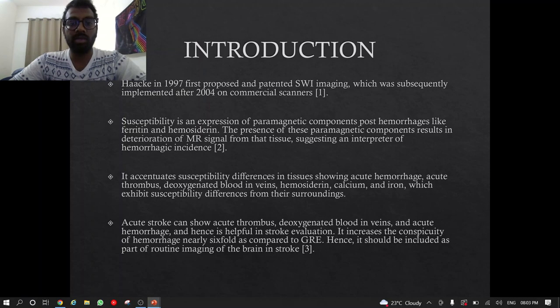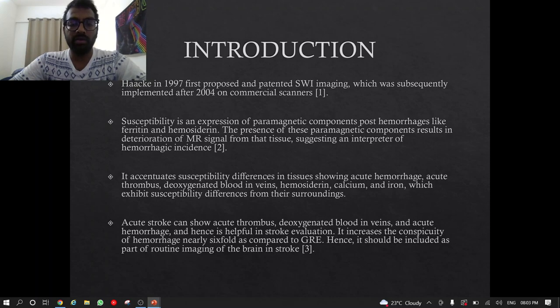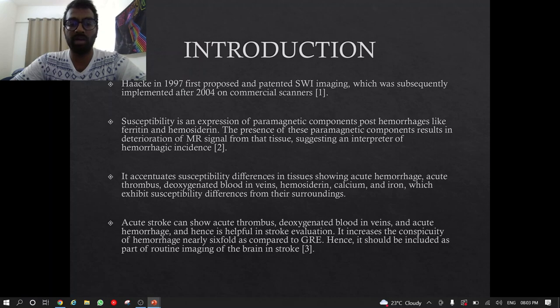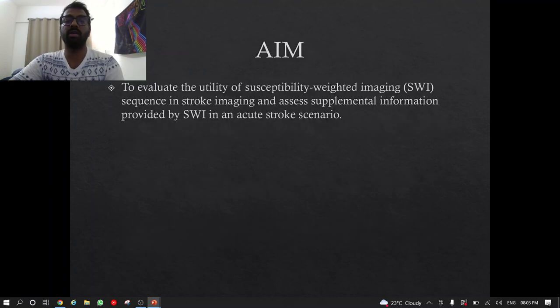It accentuates susceptibility differences in tissue showing acute hemorrhage, acute thrombus, deoxygenated blood in the vein, hemosiderin, calcium and iron, which exhibit susceptibility differences from the surrounding. Acute stroke can show acute thrombus, deoxygenated blood in the veins and acute hemorrhage, and hence SWI is helpful in stroke evaluation. It increases the conspicuity of hemorrhage nearly six-fold as compared to GRE, and hence it should be included as part of routine imaging of the brain in stroke.